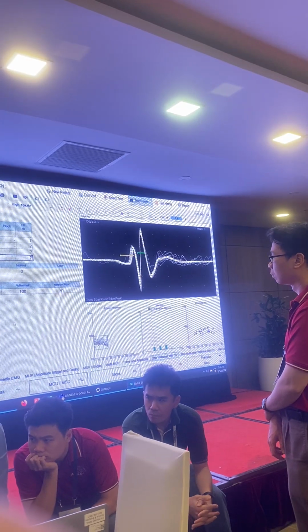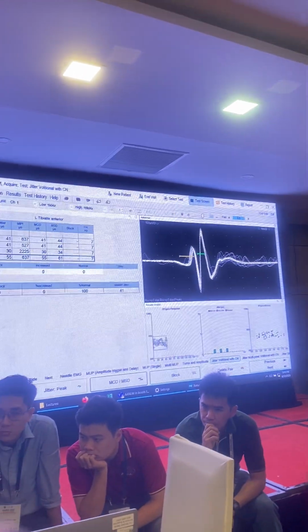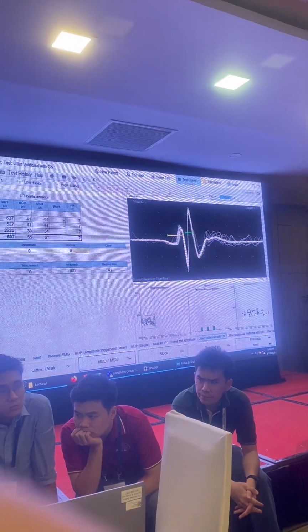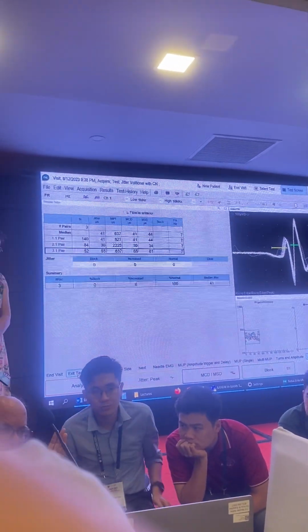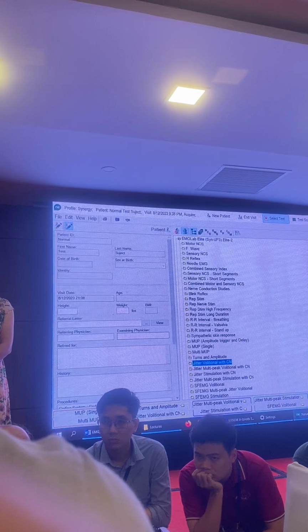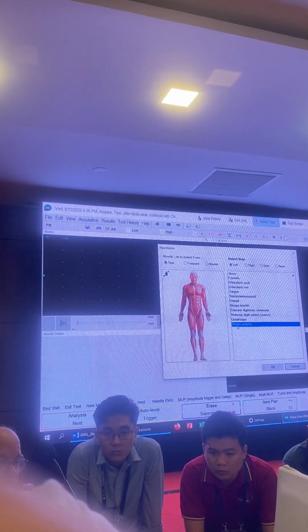Okay. Let me show now. So this is the way I like to start, by doing manually, understanding how to select a potential, how to look at the quality criteria, etc. There are advanced methods that I recommend. Once you know the pitfalls, then I recommend automated methods. So here is one such automated method.